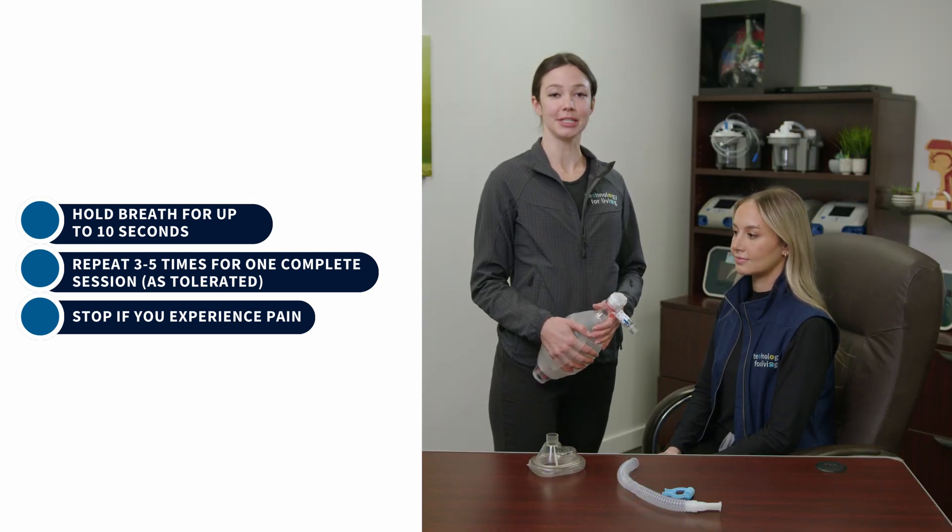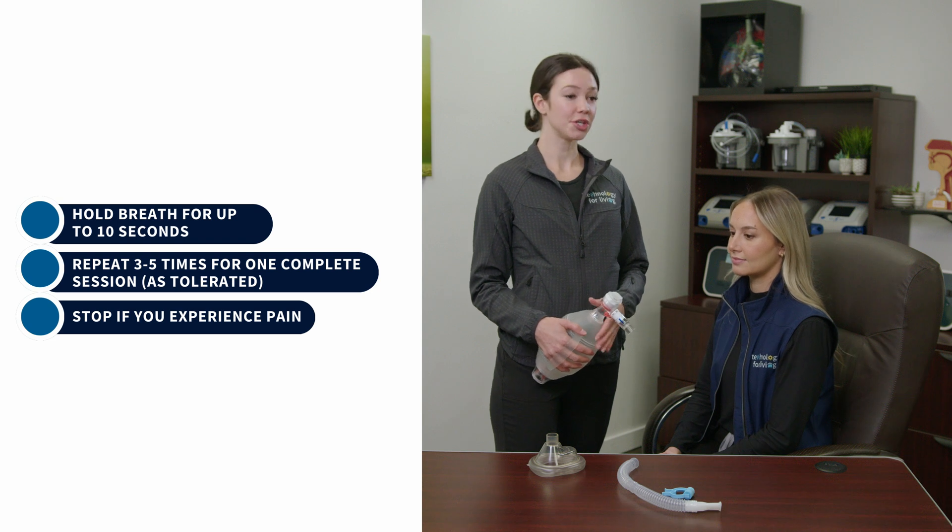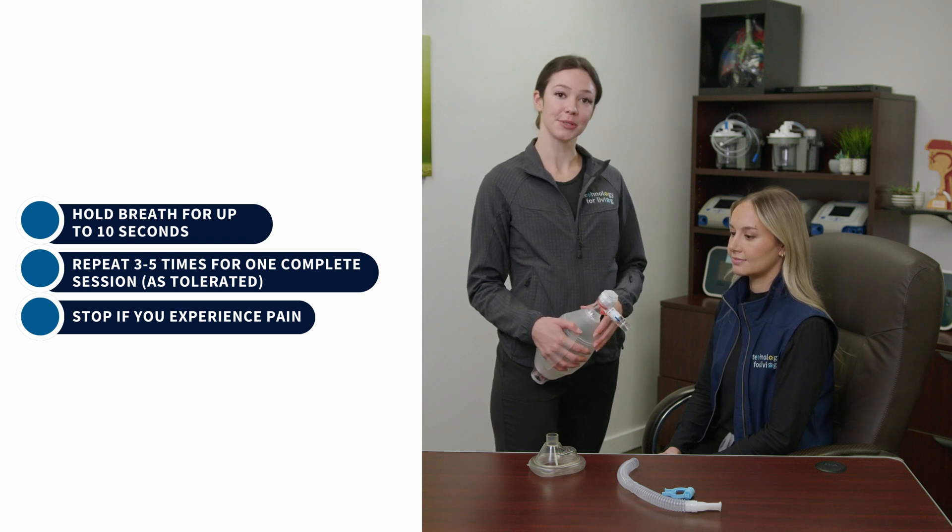This technique takes practice and coordination, so don't be discouraged if you're unable to complete it the first time you try. Make sure you're communicating with your team member throughout. Please see the other video for how to use the ambu bag for assisting with cough. Respiratory therapy is always available by phone during business hours to answer any questions.